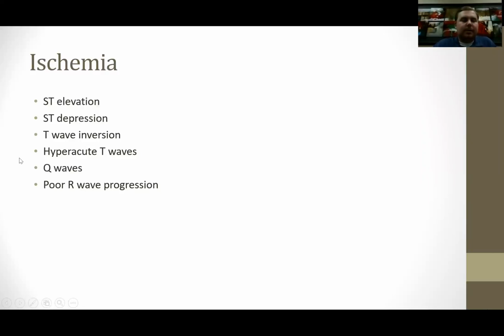A lot of paramedics in school were kind of just taught, hey, this is ST elevation. That's a big deal. So if you ever see ST elevation, start treating aggressively and get them to the hospital rapidly so they can go to cath lab. But they weren't taught the different STEMI mimics.